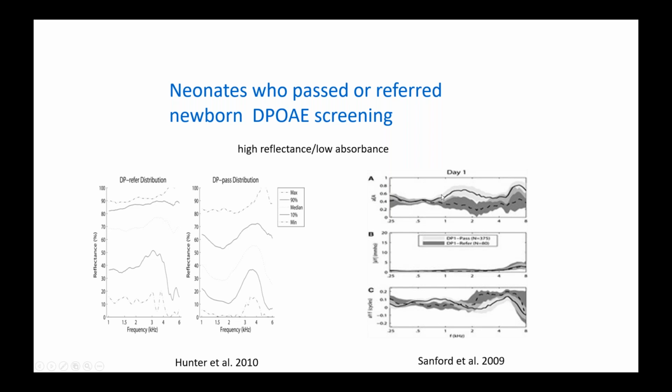This is the one with the infants who passed the newborn screening, whereas this one is the infants who referred in newborn screening. So you can see a huge difference in the absorbance, especially in the mid-frequency range, with the absorbance reduced in the infants with middle ear pathology.